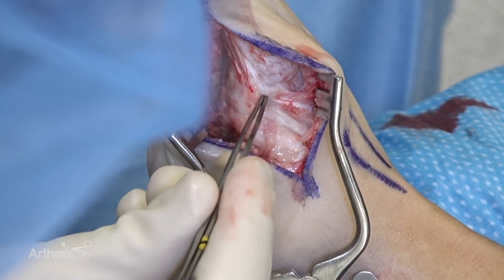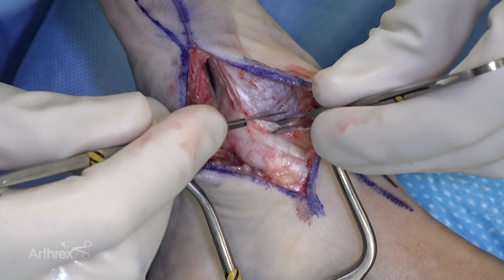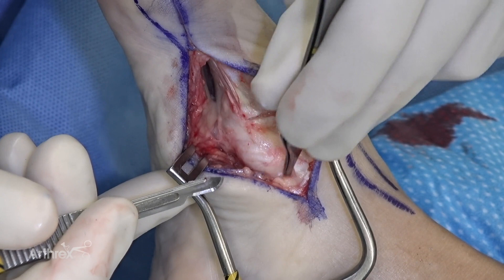Here we have the tendon coming down — the tibialis anterior — there's the inferior border and the superior border. I often do have to remove a small portion of the tendon itself off of the metatarsal. We know about 10% attaches to the metatarsal. You can safely remove that portion from the metatarsal itself, but safely protecting the bulk majority of the insertion of the tibialis anterior right here.